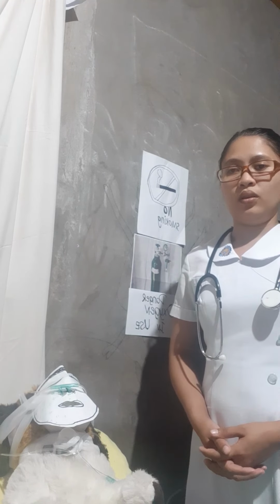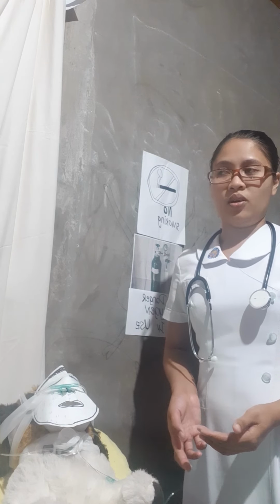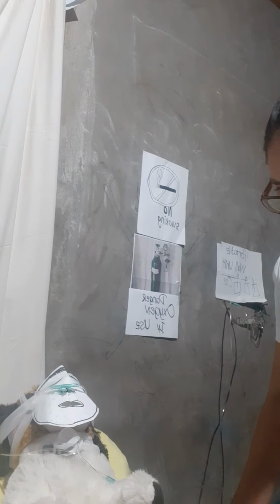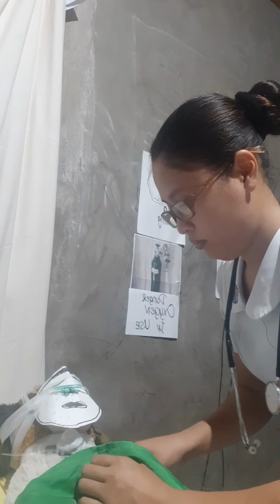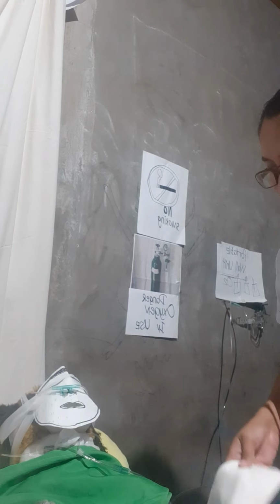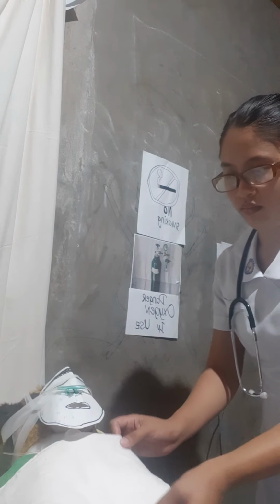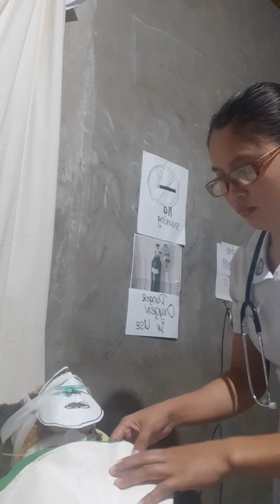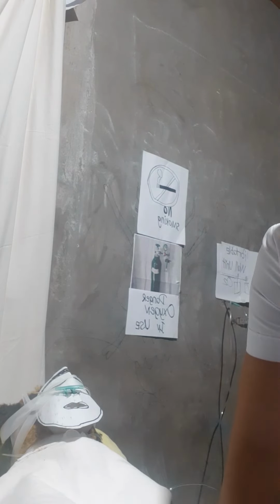Next, place the towel or waterproof pad on the chest of the client to protect him from any secretions.